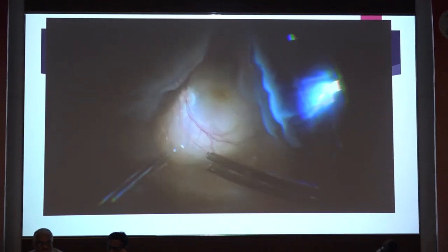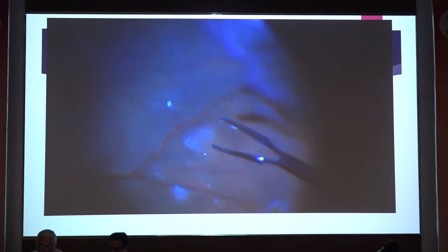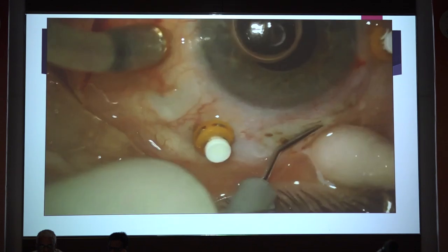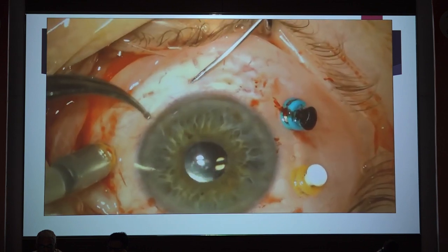After going inside, we found that there's an RD also, and along with the RD, we can see some nucleus fragment which has gone subretinally. Suddenly, it has become a long case, and it was never ending. So we did ILM peeling under PFCL, and still lots of matter we can see. Did a retinotomy to remove the larger piece, and the smaller piece was very difficult to remove, even with the help of PFCL. So it was followed by the secondary IOL, and the end result was good.